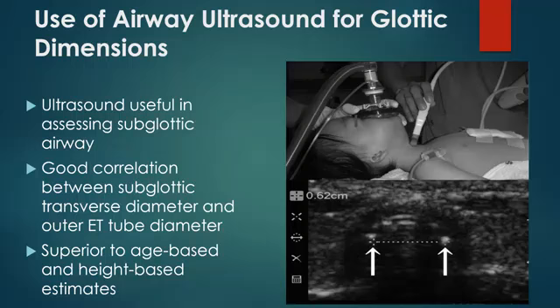And there was all the discussion and fight about whether or not to be using an endotracheal tube cuff in children. Now we're all pretty much using it, but at least I guess it's a regional or a cultural decision. But here you are making a very nice little estimation of the child's tube size. Here you've got 0.62, which is the outside diameter of the endotracheal tube, which is probably a 4.5. But you can see here that you're measuring basically between the subglottic transverse diameter on either side and getting this nice little measurement here.